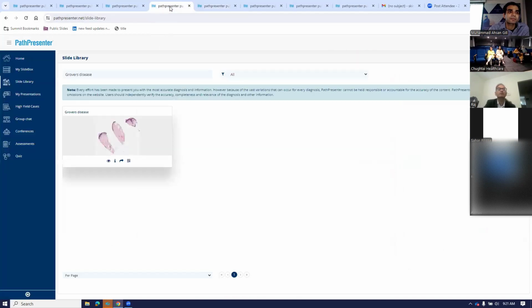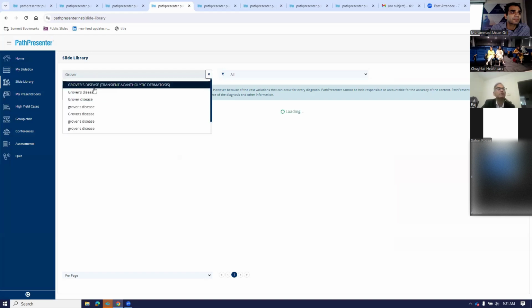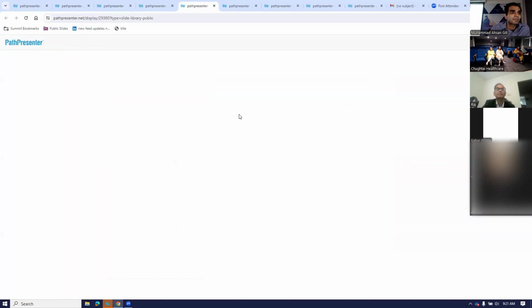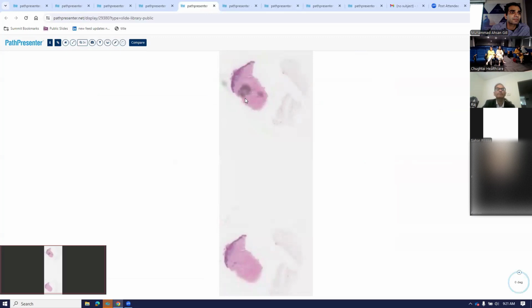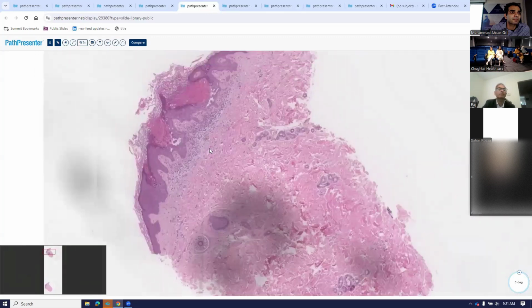This is not a good case. Let's find a better case basically for Grover's. So I want to show you something that is very classic so that you remember the stuff basically. Yeah, this one is good.